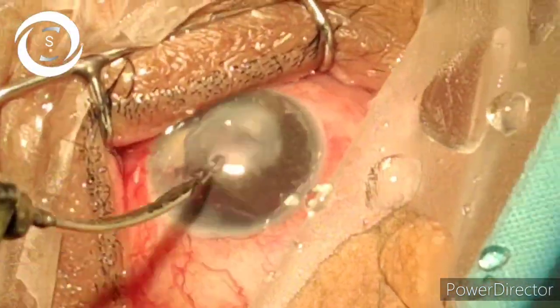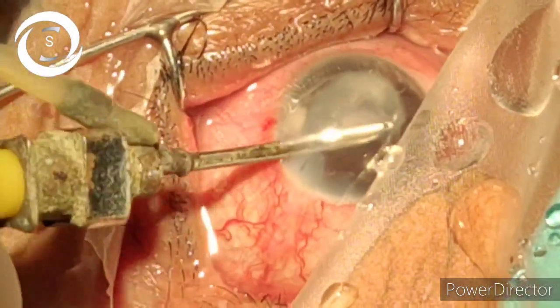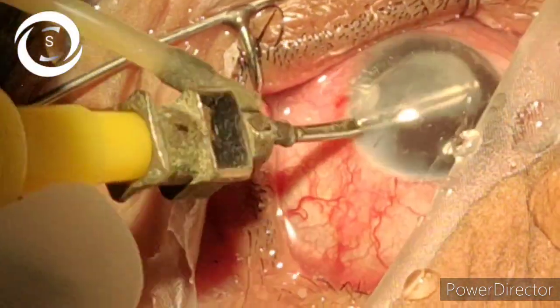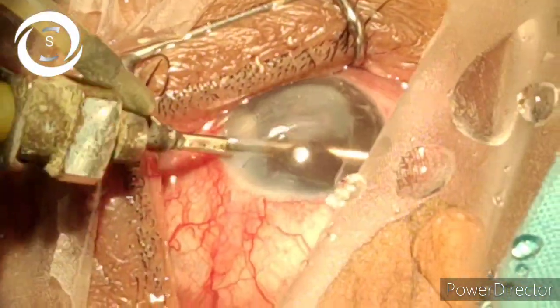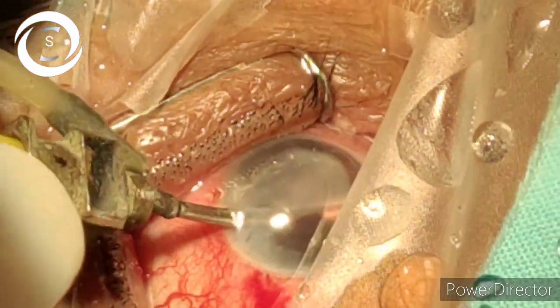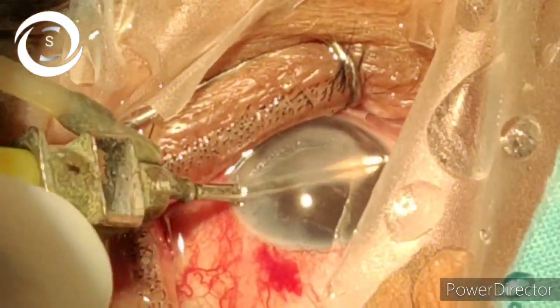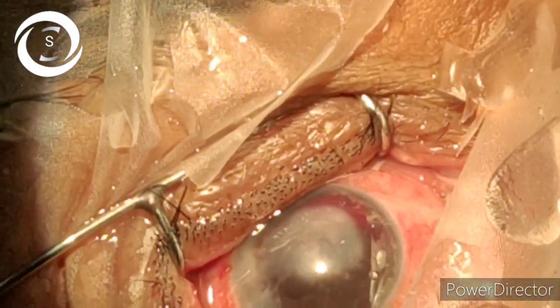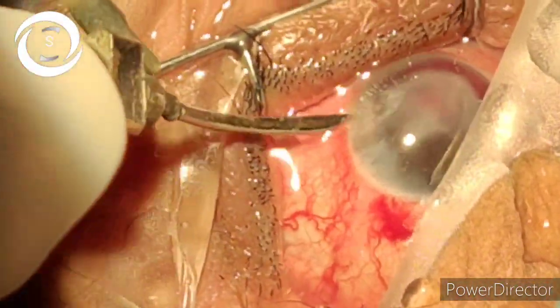You can see that the anterior chamber is now almost clear. But again there was a lot of exudate behind the iris as well, so that's also an important point: when you clear the anterior chamber, make sure that you remove all the posterior synechiae — like here I am clearing the anterior synechiae between the cornea and the peripheral iris — and then try to wash the exudates in the posterior chamber as well.